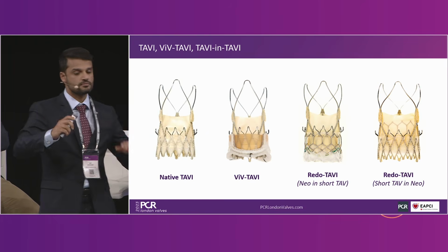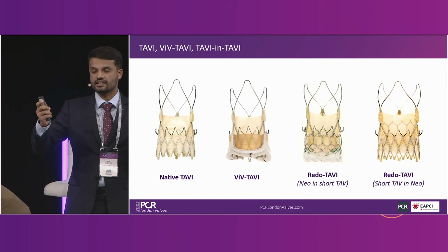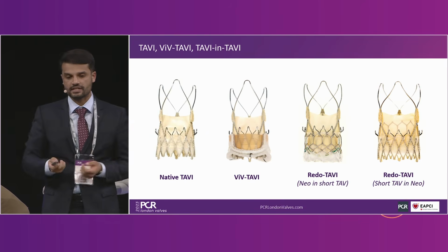Great, thanks, Ollie. It's a pleasure to talk to you about coronary access and some of what we've learned. We've discussed the Evolut valve, and we know the Sapien is a short frame, so I'll focus predominantly on the Accurate Neo valve. A lot of the principles, challenges and techniques apply across the spectrum of TAVI procedures that you do with this particular valve, because you maintain the valve geometry independent of whichever valvular complex that you have.